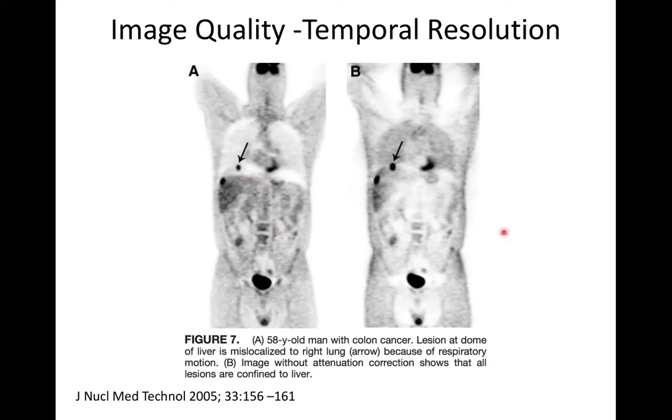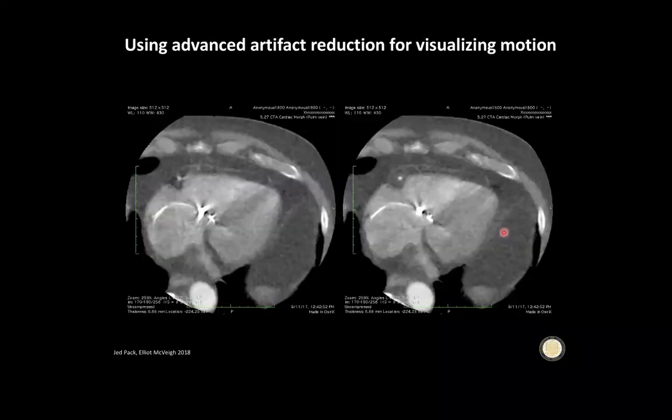And so there, again, it's respiratory motion. Can you acquire all your data at the same respiratory phase or within a breath hold? And in this case, obviously, it's no. And that's probably not going to be the case for PET for some time. So you need to do some kind of correction. Here is an interesting correction.